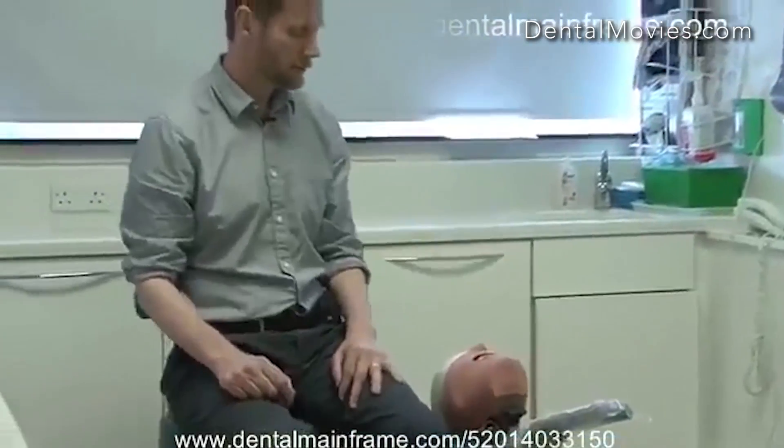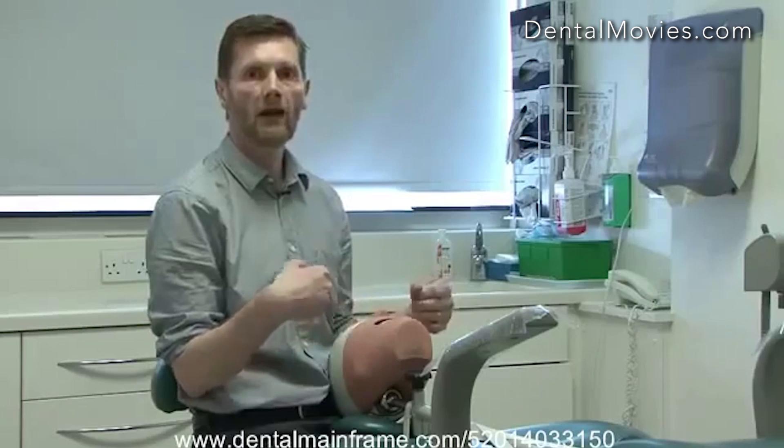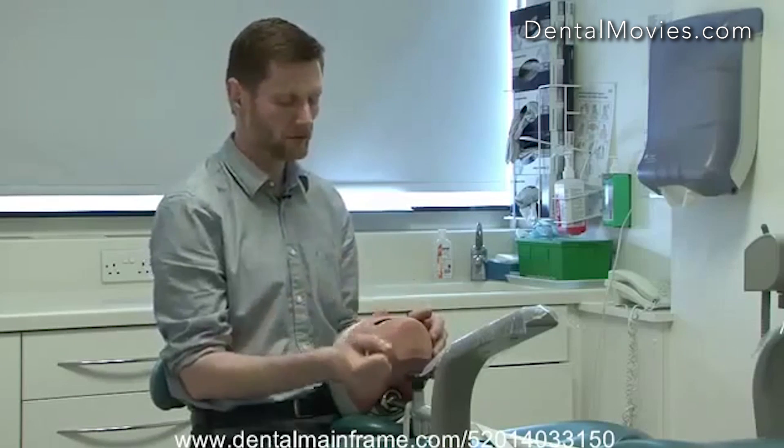Now that I've got the patient appropriately reclined, they're far too low for my working position, so we need to bring the base of the chair up so that I can maintain good posture. I'm bringing the base of the chair up so that I can work with my forearms slightly raised, and it allows me to get underneath the chair to get much closer to the patient. We talk about assuming various positions on a clock face — this is typically referred to as the 11 o'clock position.